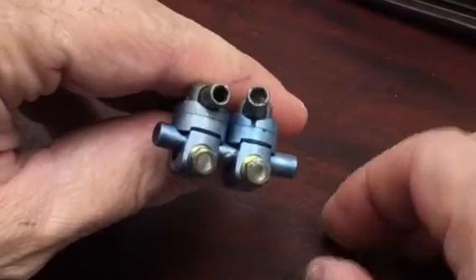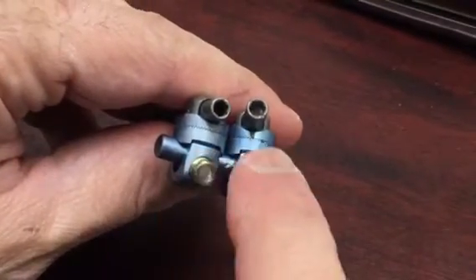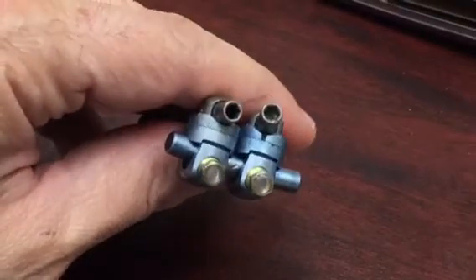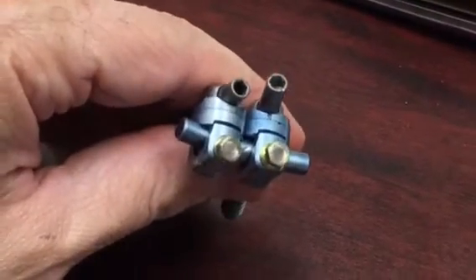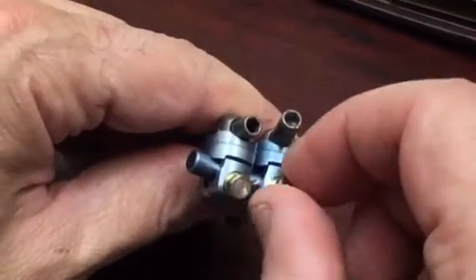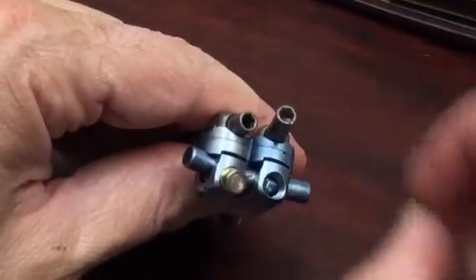The first thing that you'll see when you do this case is these hexagonal nuts, and these are the first things to be removed. There's a specific driver that Medtronic has, or you can use any driver that you have — you should be able to get one that fits. It's pretty simple to take these off.